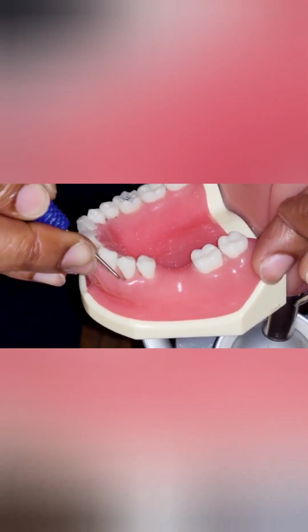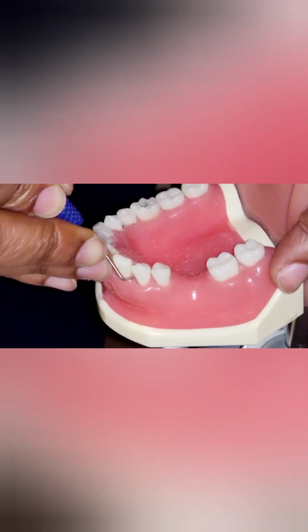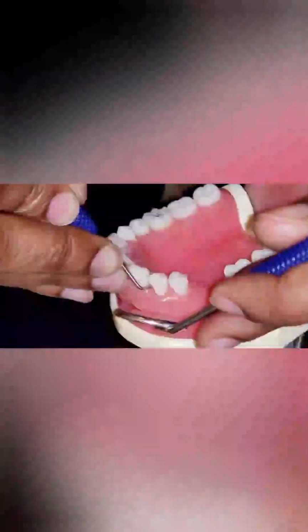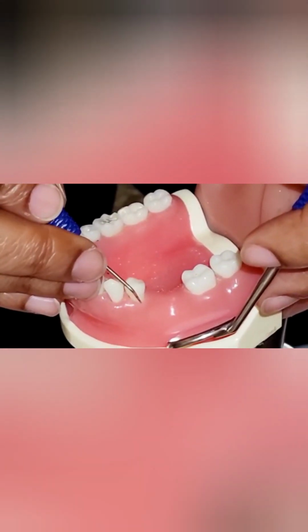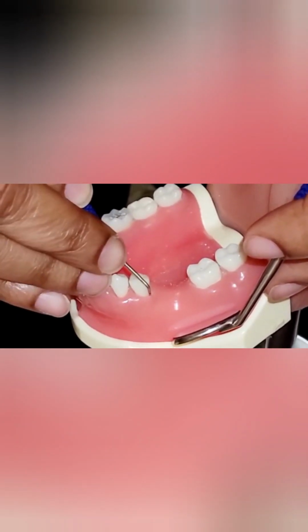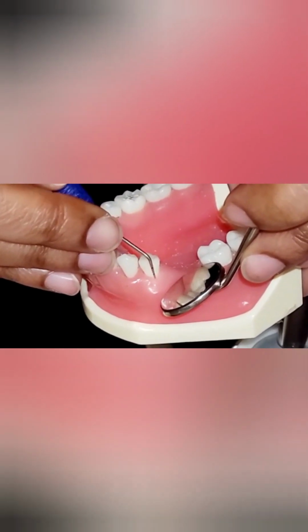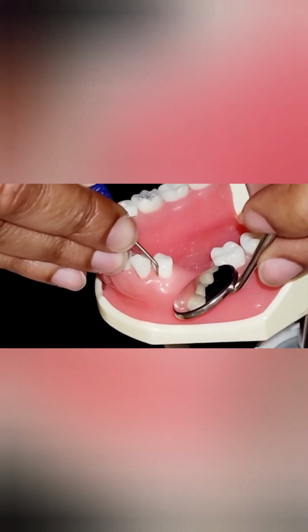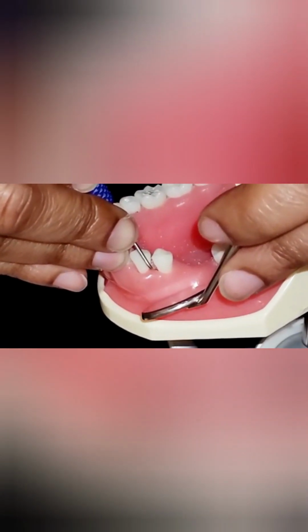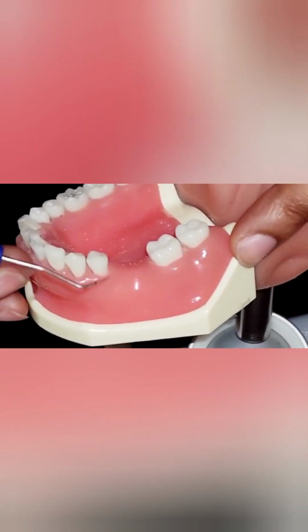Oh, slippery. 8. 9. 8. 7. 8. We're missing our first molar, which is tooth number 19.